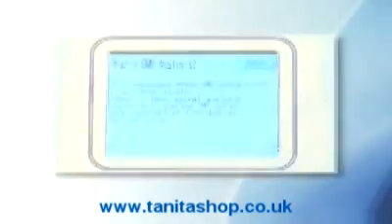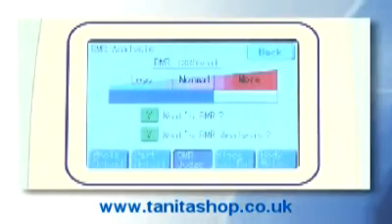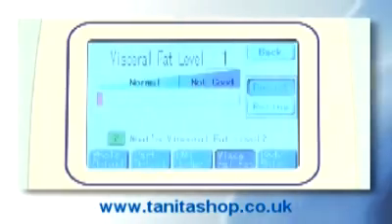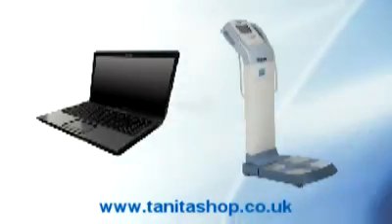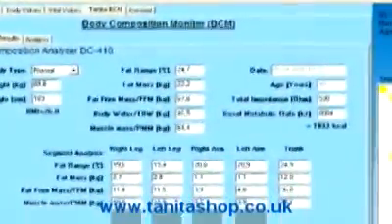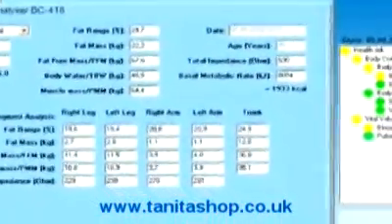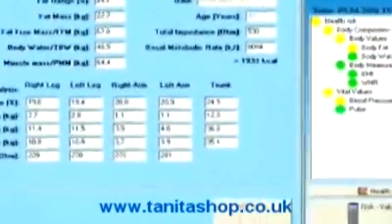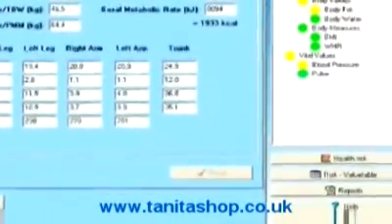All measurements are instantly shown on the colour touchscreen panel with accompanying explanatory texts. The data can also be automatically downloaded to a PC using Gmon medically approved software, allowing instant capture of data. The advisor will be able to see the present user status, track past results and set detailed future targets, allowing complete information for a full consultation.